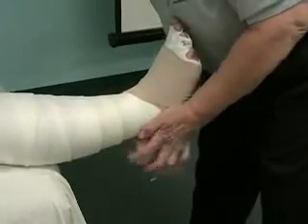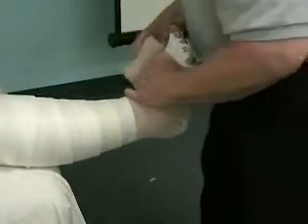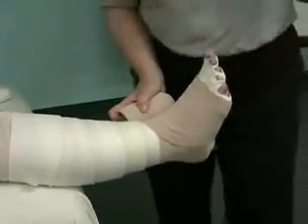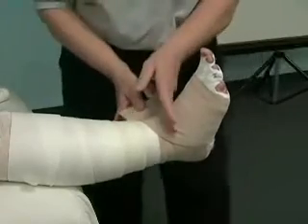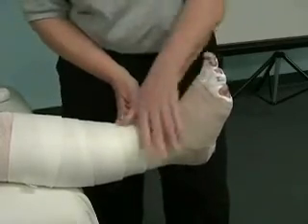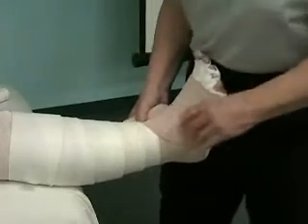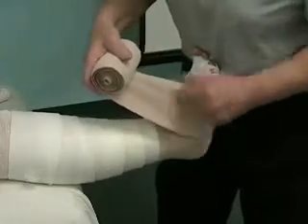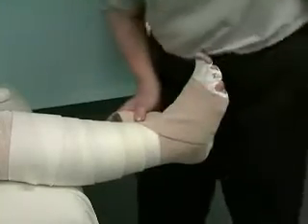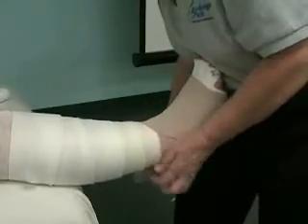Now I'm going to come around, but now I have a greater luxury of how I'm handling my bandage than the short length. Now I can come down, come around. And now the key thing here, few points. When you get to the top of the ankle here, this bend, it's really important that you just put your hand here and don't overstretch the bandage. What happens is, and sometimes I forget to say that, you see when you recoil, if you come around here and recoil, it'll spring. But when you come here, lay it down and just smooth it. Don't mold it, because you're going to have many layers here and it becomes painful.